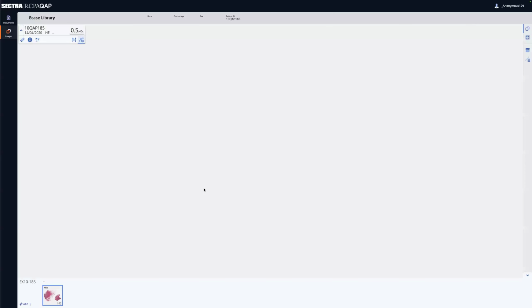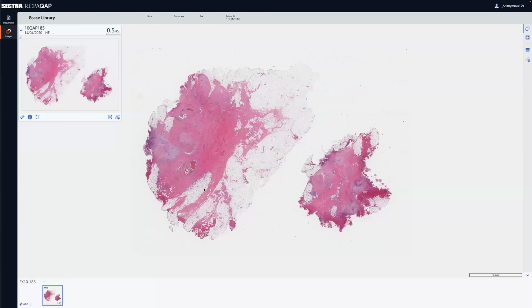Endometriosis. All right, how many times a day do you guys see endometriosis? How many times a week do you guys see endometriosis? We'll do it by week because not everyone is buried in gynae. Yeah, it's really common, isn't it? So for me, a gynae pathologist, I'd say 3 times a day at least. It's really common. And sometimes it's quite subtle.